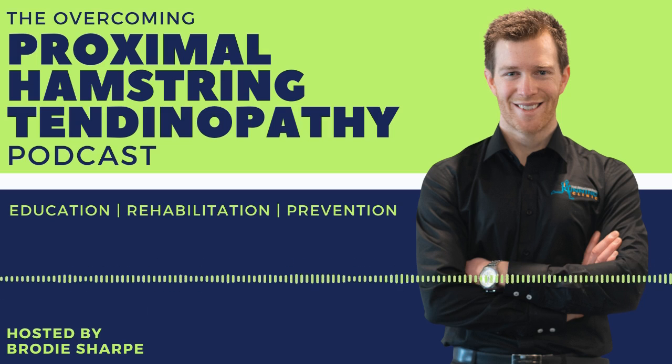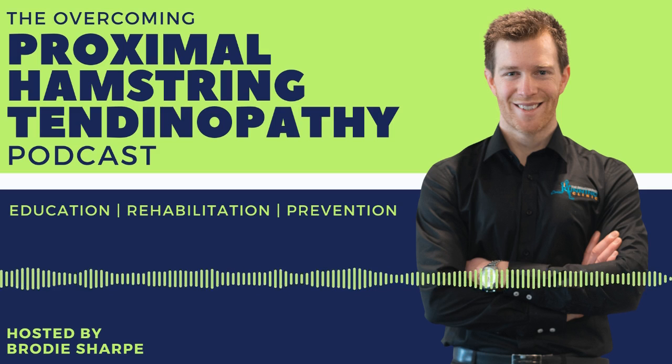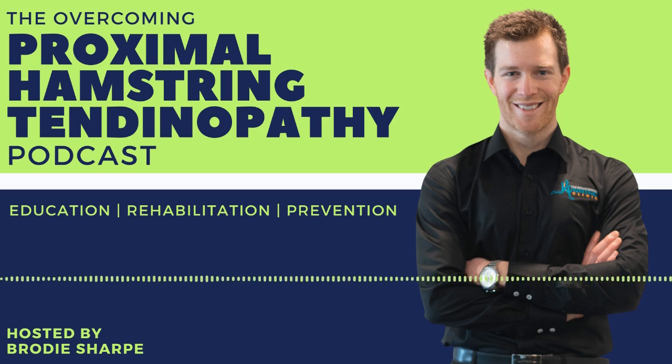So for example, I'll give you a case where I treat on the NHS, where I get a bit of deconditioned patients. If they come to my clinic, they're struggling, they can't even do like 10 or 12 calf raises, I won't give Shockwave. They're not strong enough to have Shockwave. So a lot of the time you need a bit of rehabilitation just to make them strong enough to handle the Shockwave before you can give them, because it's a painful stimulus. Your body should be good enough to handle that.